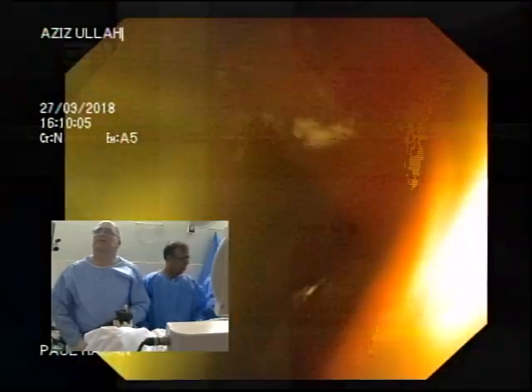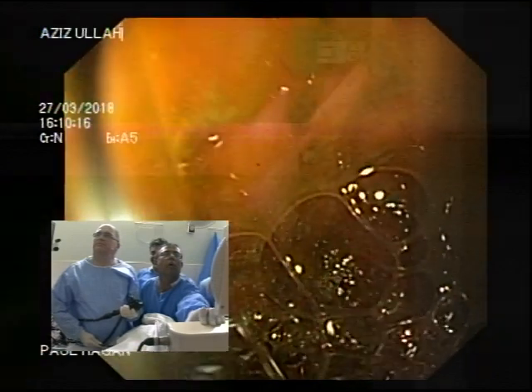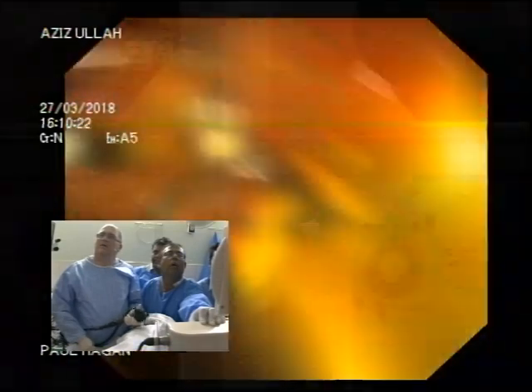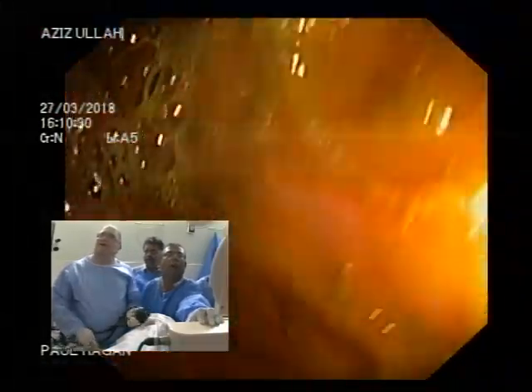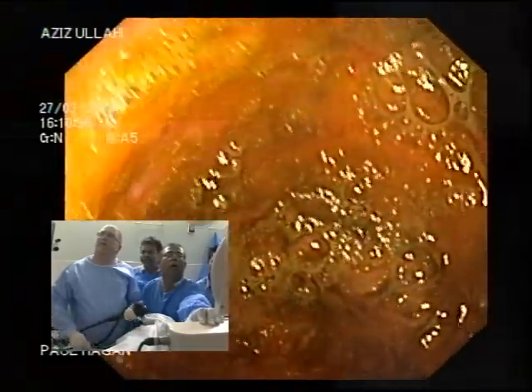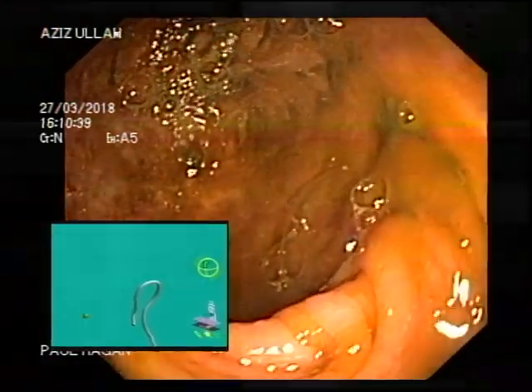My friend, can you go back onto your left for me? To approach the caecum, the left lateral position will be best. It changes where the stool is, not for getting in. It's actually disadvantageous for the IC valve, but it helps. These areas are normal? What do you think? It's not inflammatory? No.